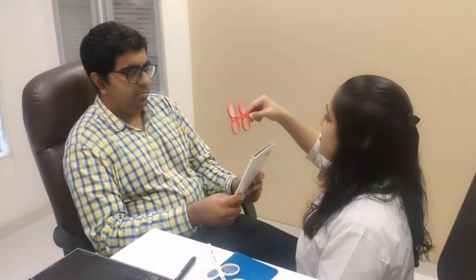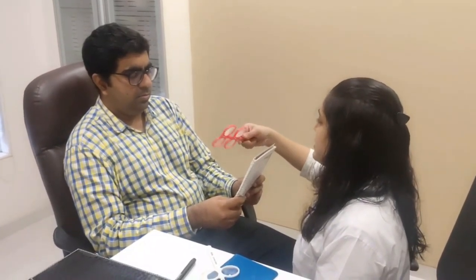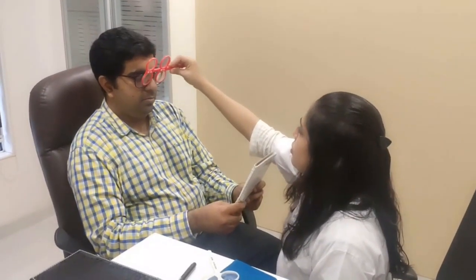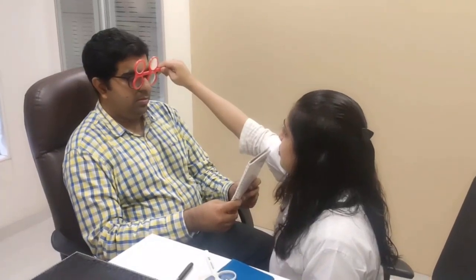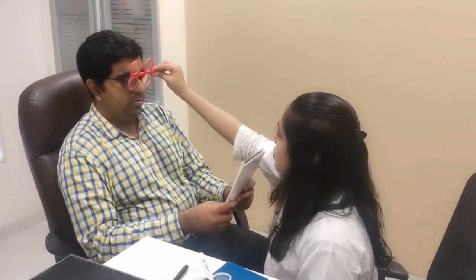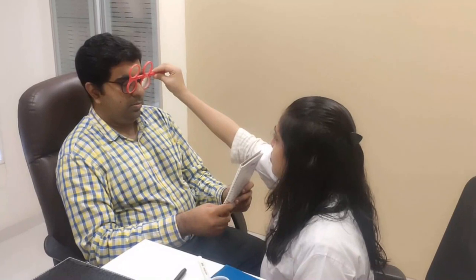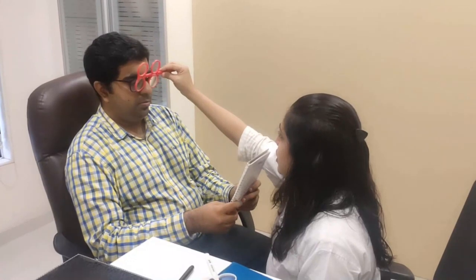Let's now look at the Vergence facility using a 12 prism diopters base out and a 3 prism diopters base in Vergence flipper. Please look at the print. When it is clear, use the word now. Is it clear? Yes. Now. Yes. No. Now. Oh, no. Now. Yes. No. Just clear now. Now.